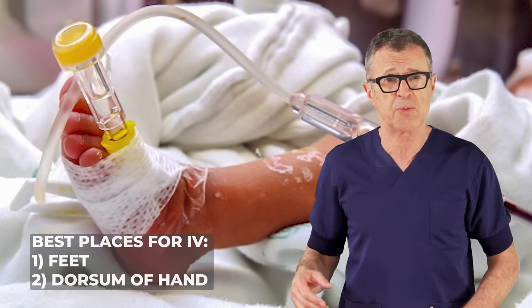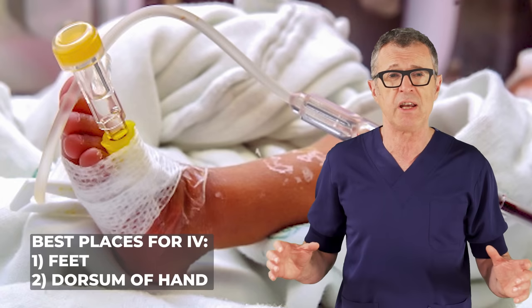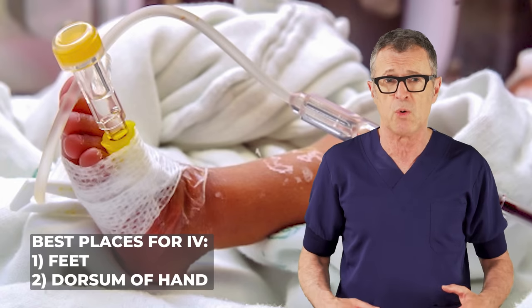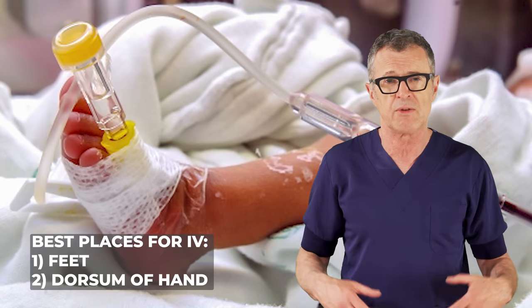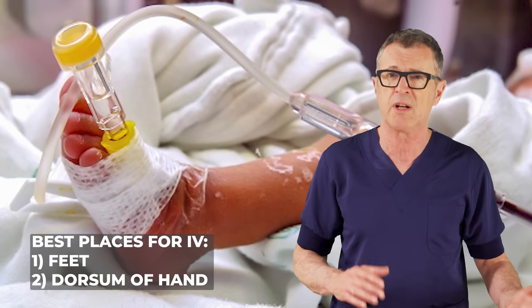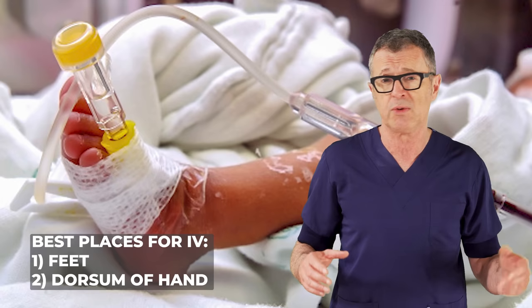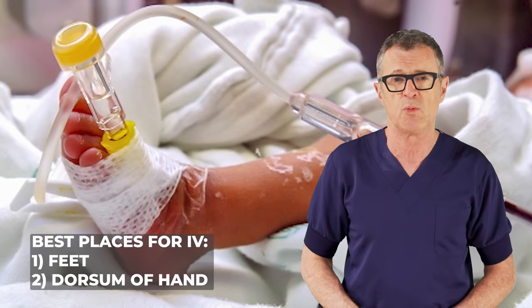Tip number 2: Pick the best sites for IV. There are a few options for where to place a pediatric IV, but the best options are the feet, because many infants have a big, juicy, long saphenous vein or the saphenous vein itself running up the middle of the anterior foot or on the medial side of the foot. Securing the veins in the foot is a lot easier than the hand, which is a lot more movable.